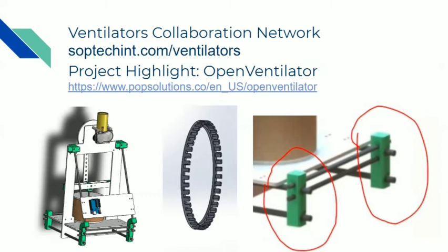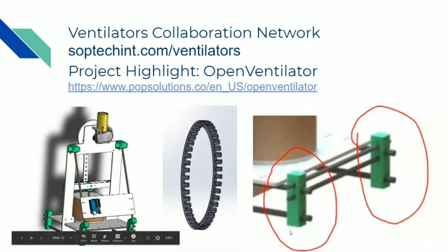Another important thing is we also have the Mark II version, not only the Spartan version. The Mark II version uses an Arduino, a rotary encoder, and normally found Prusa parts. Anyone that builds 3D printing machines knows the Prusa standard, so it's very commonly found, and makers and people that use 3D printers already know how to print those parts.